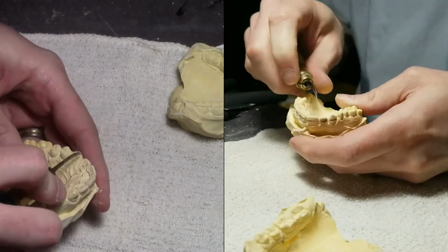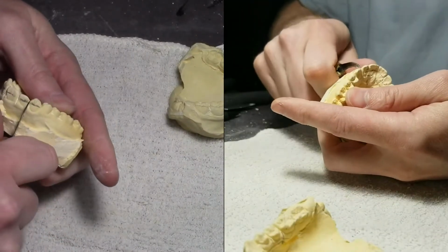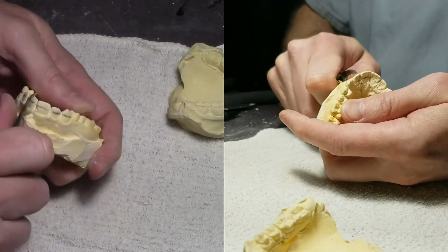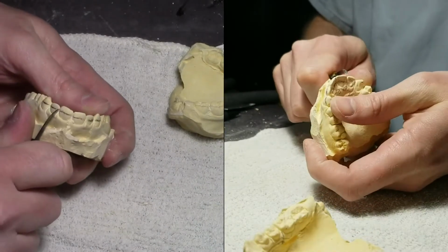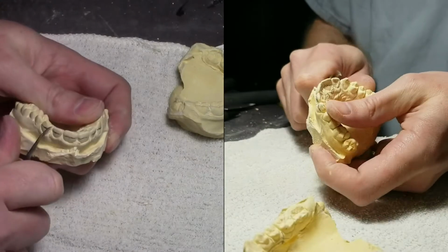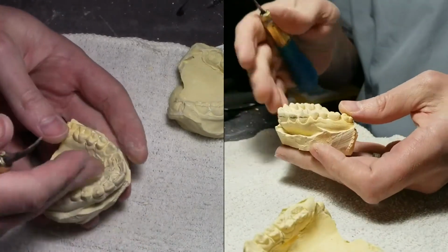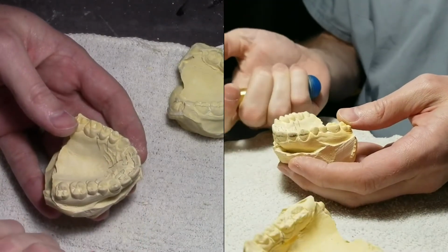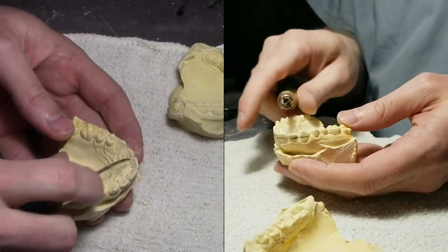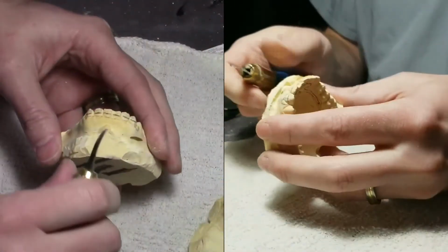Now what this is kind of like, if you're not used to this, it's kind of like glass cutting. You're trying to make a score mark or a break mark because you want these to break exactly between the teeth. Another option is, now this doctor said no stripping, so I'm doing it this way. If they said stripping, then you could probably just saw between each tooth and make a space anyway as you're cutting it out. But since it said no stripping, I want it to break right between those teeth.